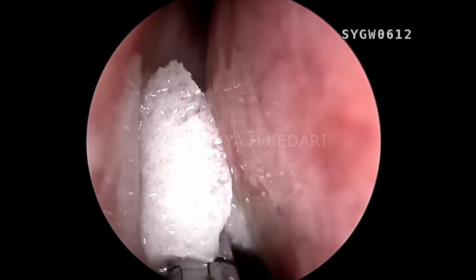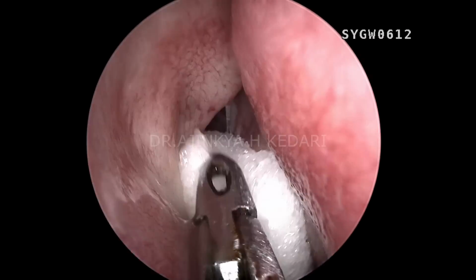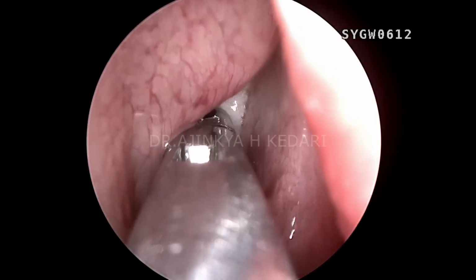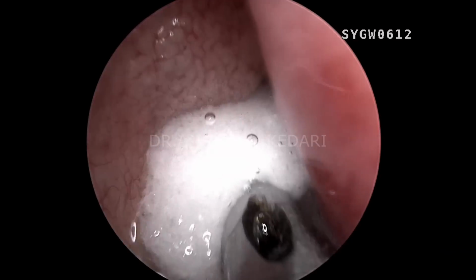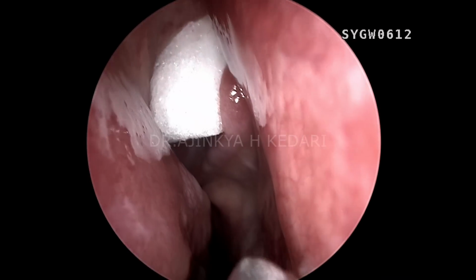So this is a surgical video, as we have discussed the scans already. So I'm going to move on to the surgical basics right now. As you can see, this is the patient's right side nasal cavity. The very first step which I'm going to be doing is the decongestion. This step allows me to visualize the anatomy within the patient's sinonasal area much better. You can see I'm using multiple pieces of neurocell, also called merocell, soaked with normal saline mixed with 3 to 4 ampules of pure adrenaline.